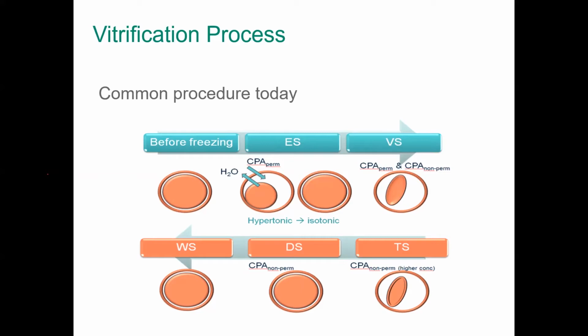But to achieve successful vitrification, we need to appreciate the cell stage that we are handling, the skills and the competency of the practitioner, the device, and lastly, the media. And this is what we're going to talk about today, media only. So we're not going to discuss the process or the device or any of the other factors that might affect the vitrification process. We're only going to talk in this presentation today about the vitrification media only.